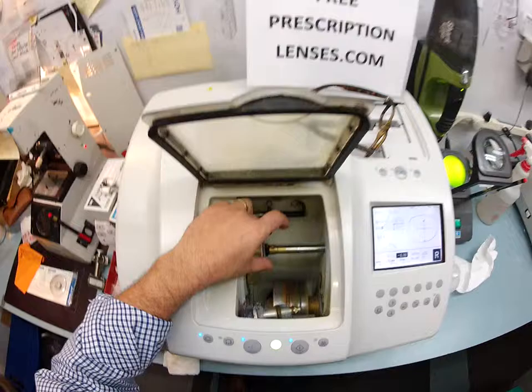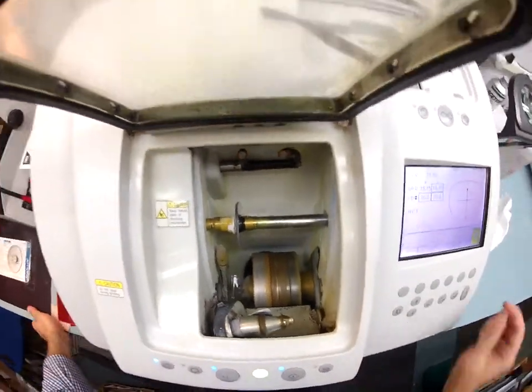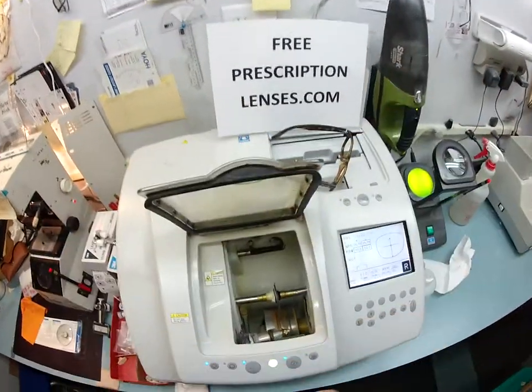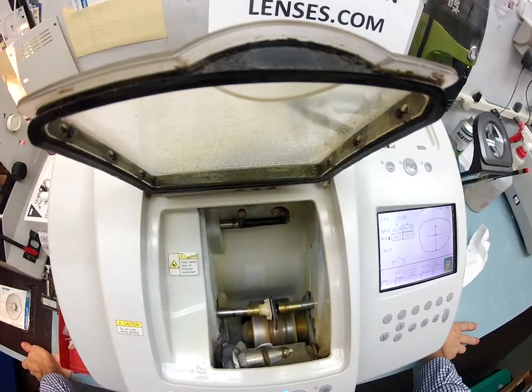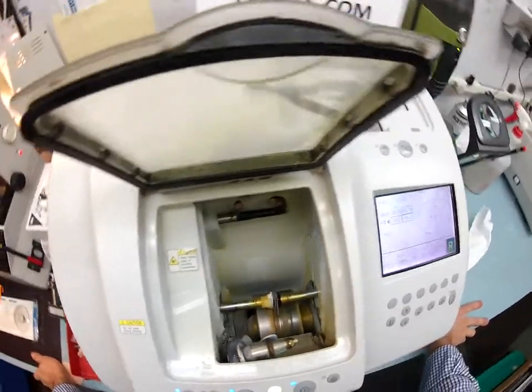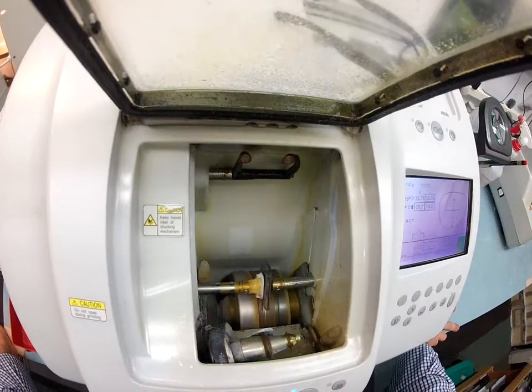It is not going to go onto the cutting wheel. It's just going to go straight to the bevel wheel. And it's going to take 1/10 of a millimeter off your lens. In fact, the distance between my thumbnails is 1 millimeter. I'm going to do 1/10 of that distance around the circumference of your lens. Harry with United Airlines, go ahead and put your seat back because this is going to be a fun ride. You're going to watch how your lenses are being made.